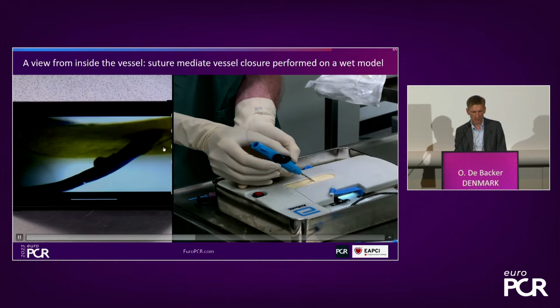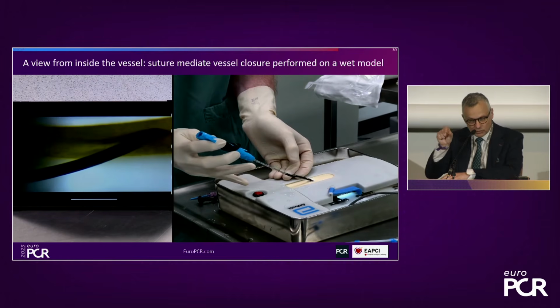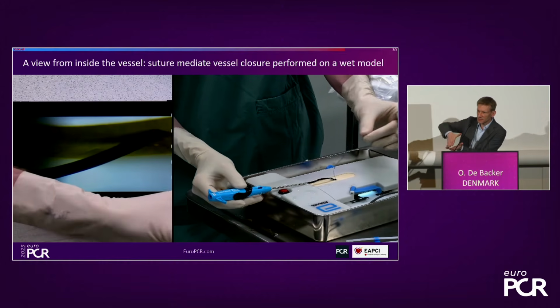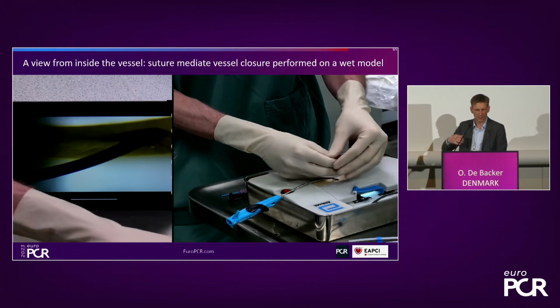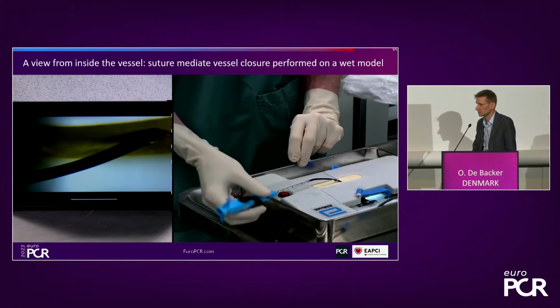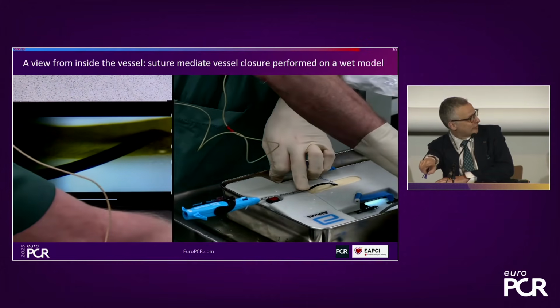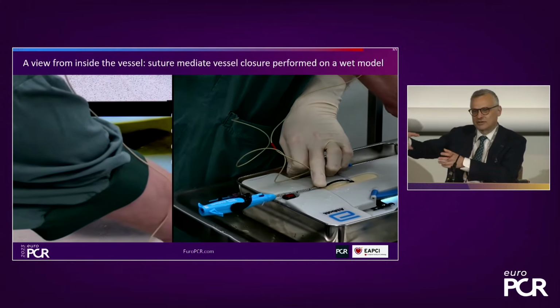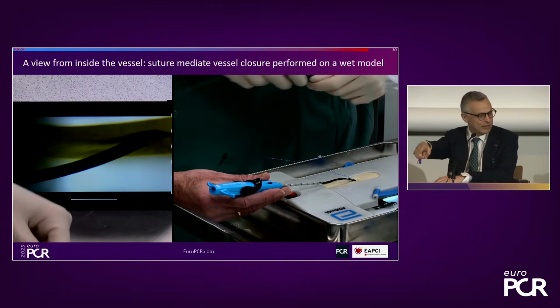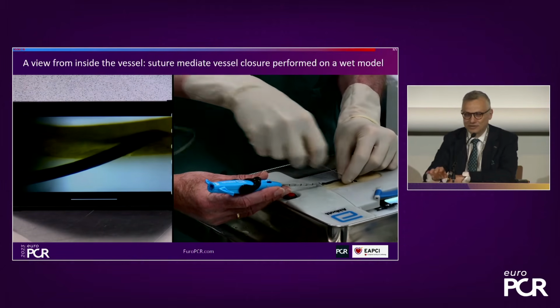So just to say again, you fire the needles, and prior to pushing down the system, you enter a bit, 1 millimeter in. Yeah, yeah. Because then that anchor can nicely come into my ProStyle again before I pull it out, and I will avoid interaction with calcium. And look at this maneuver. If you put it upside down, it will not fall out. Everybody is a bit afraid of this ProStyle getting out of the artery. Put it upside down like it was before, and it will be very stable. You don't need any help.